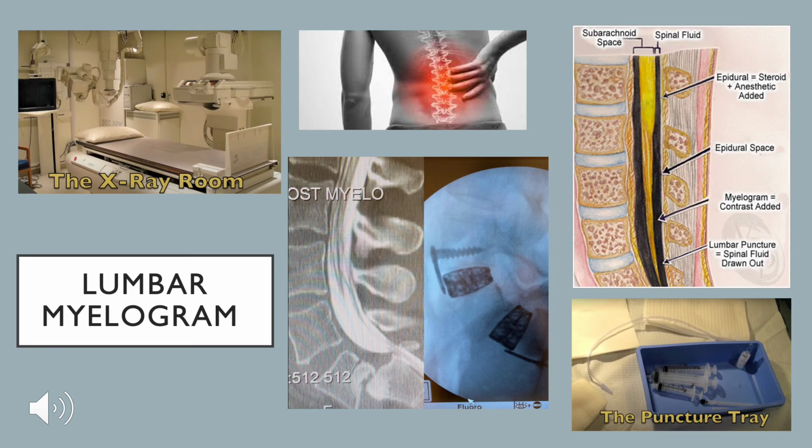After examination, patients are instructed on their aftercare, symptoms they should be concerned about, and who must be notified. For starters, resting for several hours, drinking lots of fluids to help flush out that contrast, and limiting physical activity following the myelogram is encouraged.